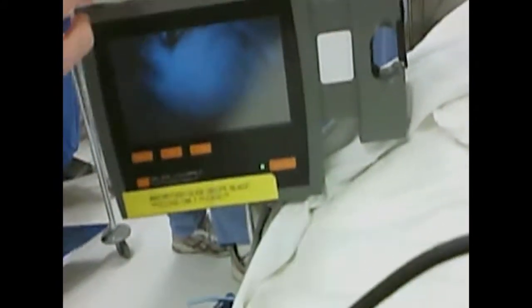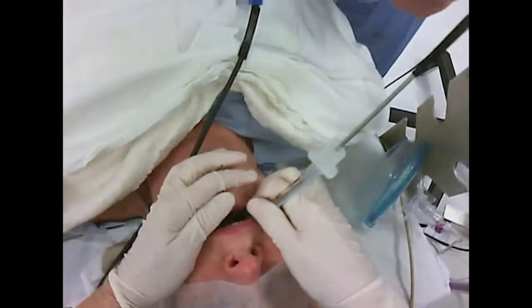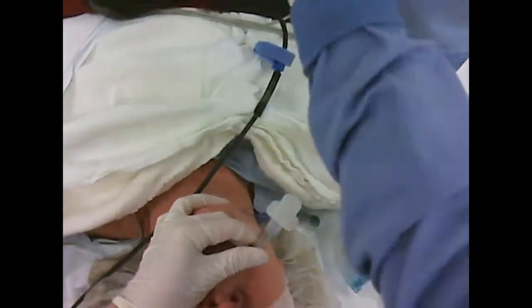Once the tip of the tube has passed out of view behind the tonsillar pillars, then look at the monitor. Rotate the tube back to midline and aim at the larynx. Slowly advance the tube through the cords. Withdraw the stylet 2-3 cm to effectively soften the tip of the tube as you insert. Advance the tube into the trachea looking at the monitor, but remove the GlideScope looking at the patient, not the monitor.